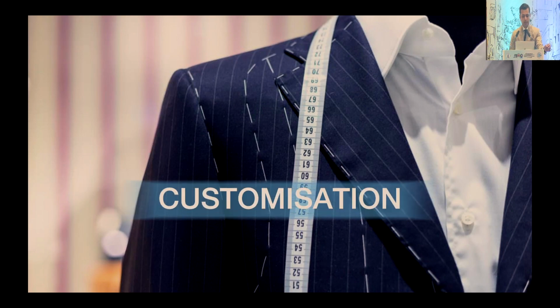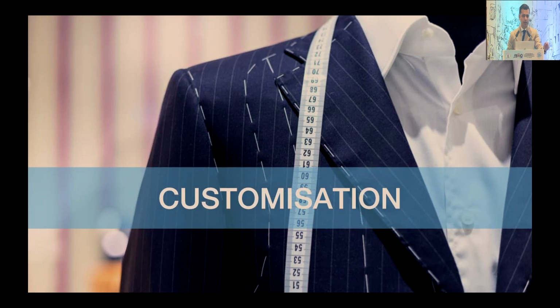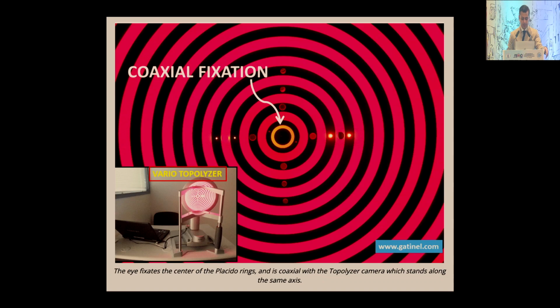And this is true customization, which is, as of now, not available with any lenticule or any other LASIK formats. So obviously not only Contoura, there are certain companies that also have topo-guided treatments, but such a level of customization is still not available with any sort of lenticule extraction.